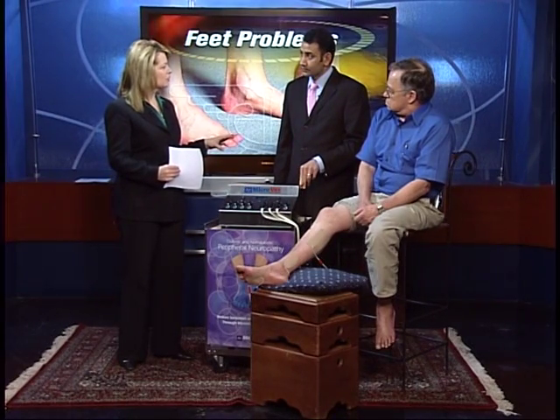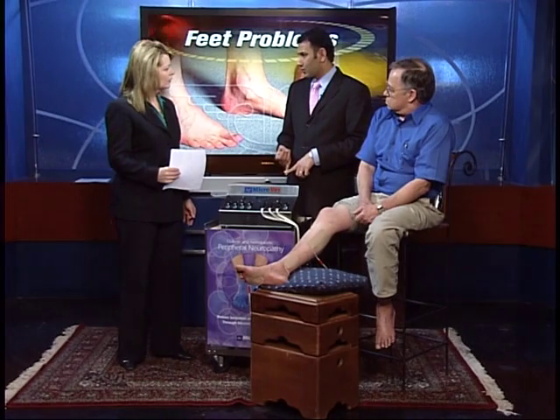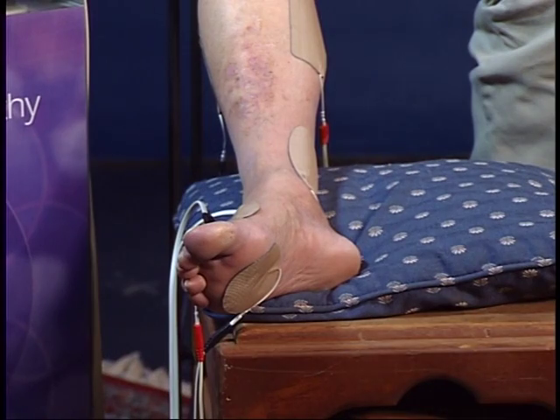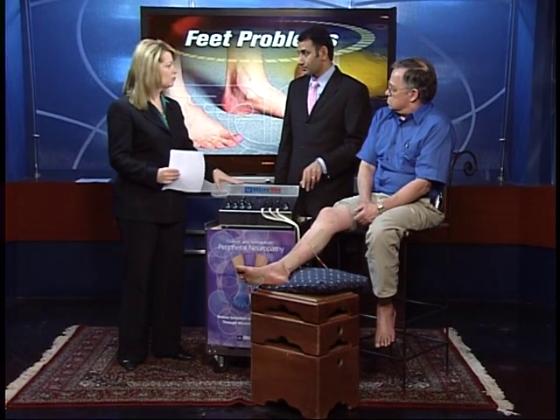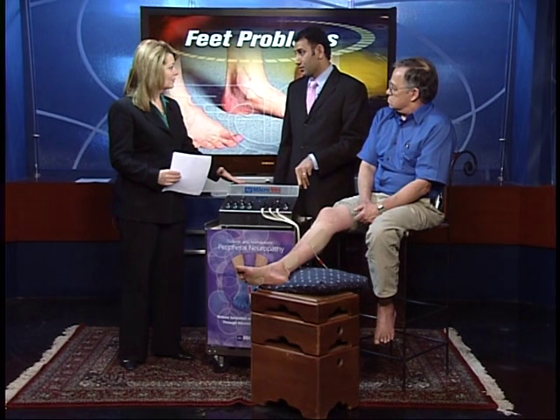What is the biggest problem with diabetes patients in terms of circulation? We have a lot of different problems — diabetic patients who are smokers, not taking care of their feet, not exercising, blood sugars running high. Can this stop the progression of poor circulation? Absolutely. It'll help improve circulation as long as you're using the device, and the effects last up to six months to a year. Patients will come in for three to four weeks, feel better, and then six months or a year down the road we'll reevaluate them and they might need another session.